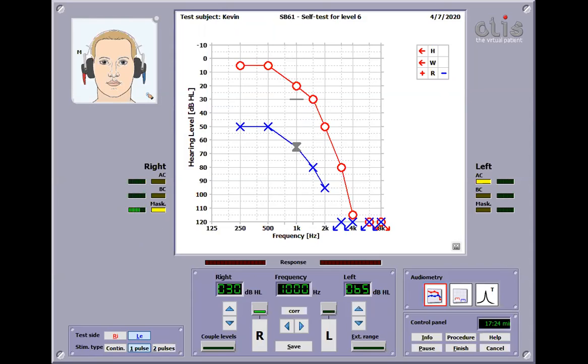Before that, you have to instruct the patient that there will be a noise from the right ear in this case, and it sounds more like water, or white noise, like when the TV is not working. Ignore the sound, just concentrate on your left ear, and only respond to the pure tone signal. Most of them will understand. Sometimes you have to take the headphone off and re-instruct the patient to make sure they know what they're supposed to do. Anyway, let's get started.